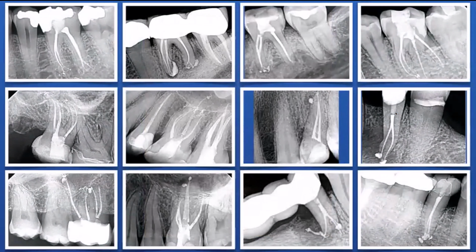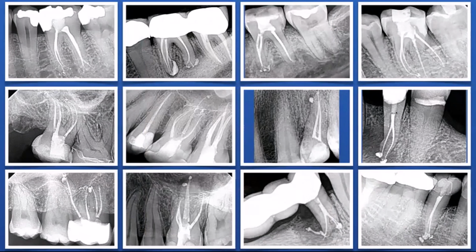And this type of result with these slim shapes using high level irrigation has allowed us to achieve results like you see here. And there's just a bunch of cases that were completed recently by me in my practice, just to highlight the preservation of dentin, nice obturation, nice flow of sealer, multiple portals of exit on most of these cases.